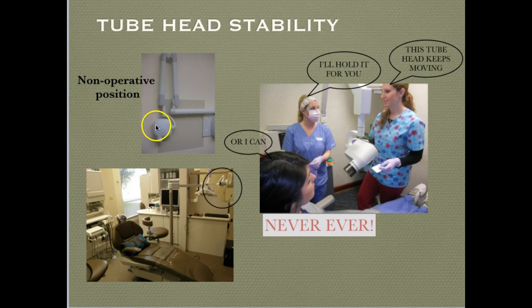Also, it's good for safety to have it in a non-operative position. I just found this picture on the internet. You can see this x-ray head just kind of hanging out here. You could have an accident or just have undue stress on the arm of the tube head.